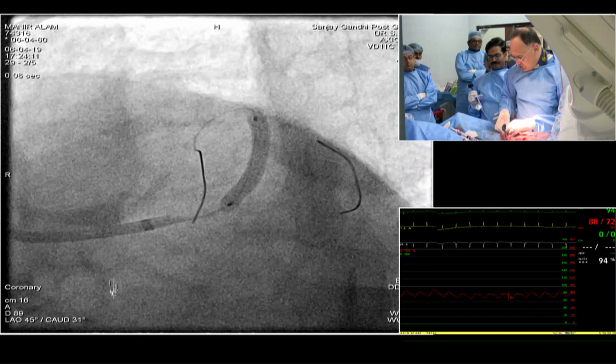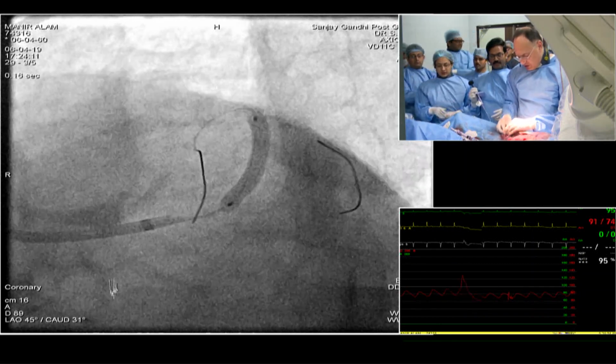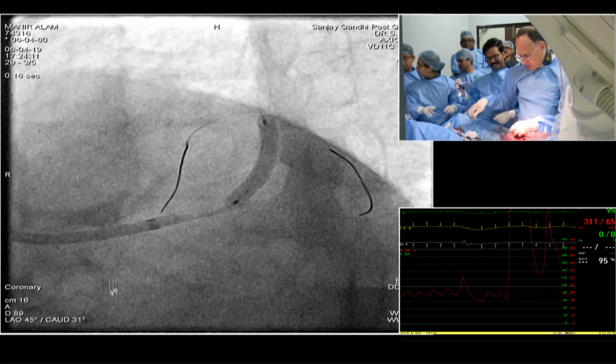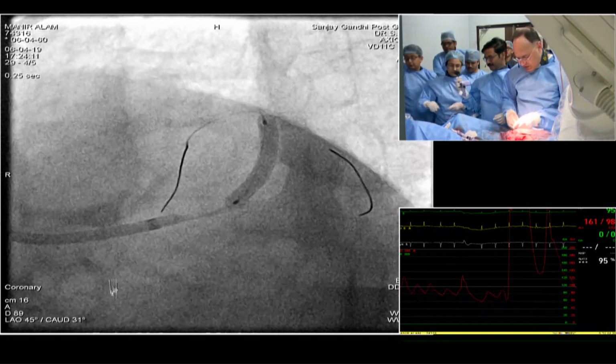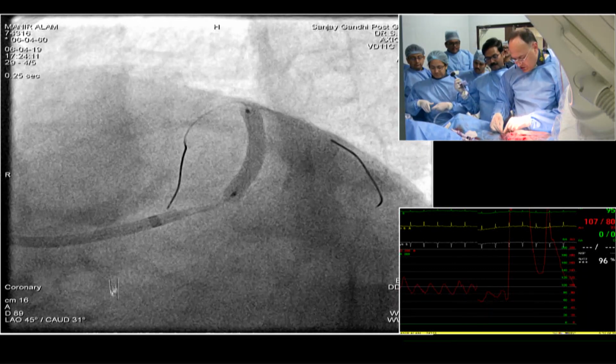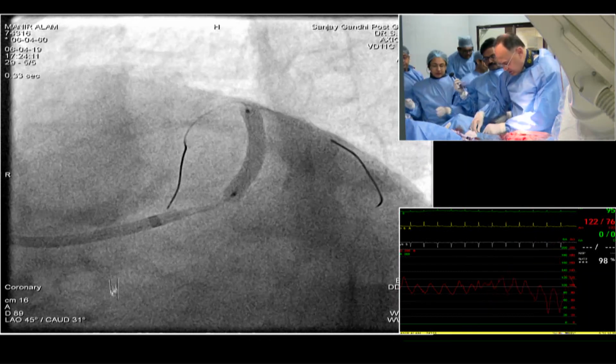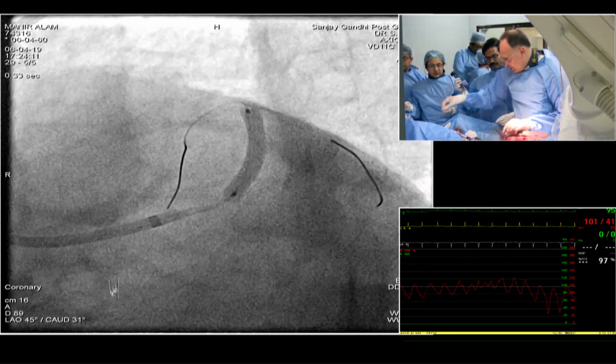We're going to do an OCT, and so we'll see whether we're perfectly aligned where we should be. I can almost guarantee that it's going to look perfect. Okay.